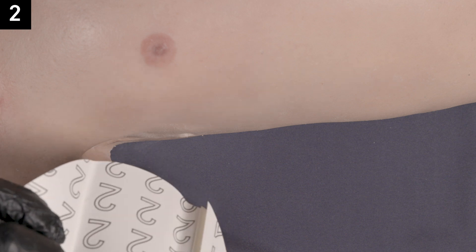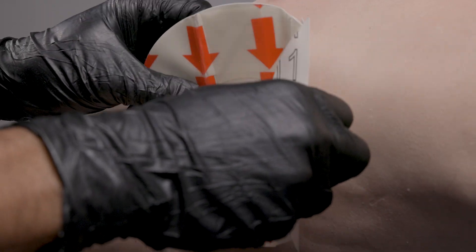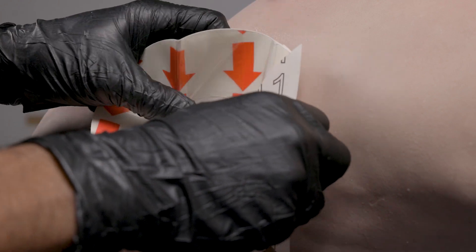Step two: pre-position the chest seal over the center of the wound with the arrows pointing toward the ground.